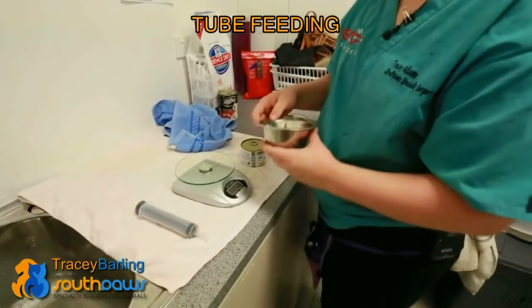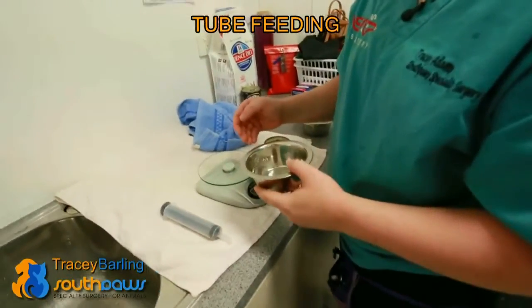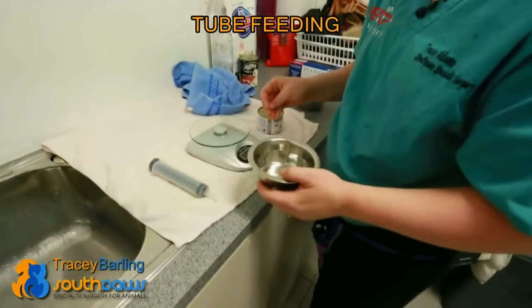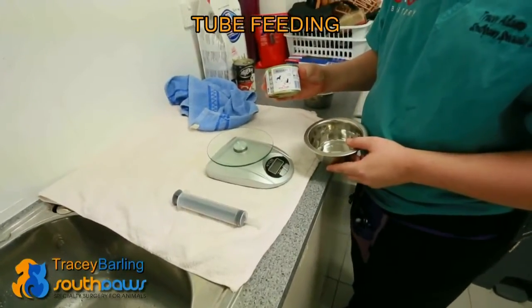We've placed a feeding tube so that we can feed Jinx adequately while he's healing, and then we'll want him to be able to eat by himself. We calculate a feeding plan for the cat according to his body weight and also according to the food that we feed through the feeding tube.